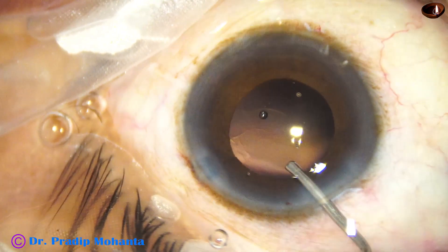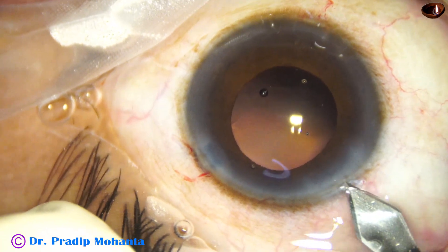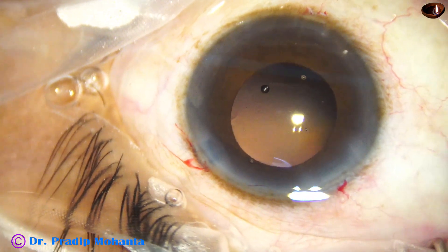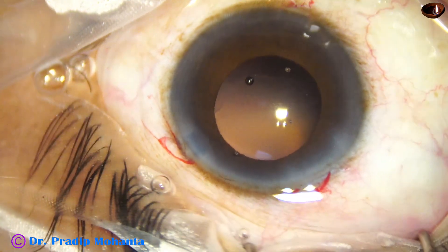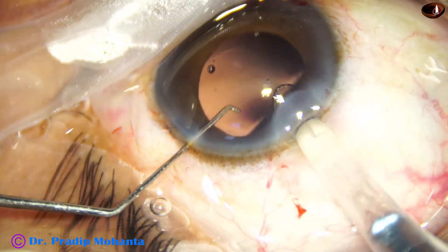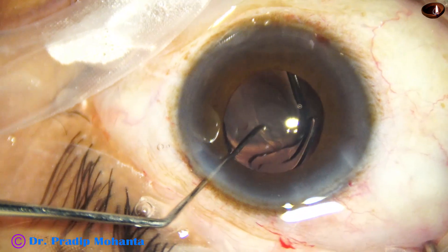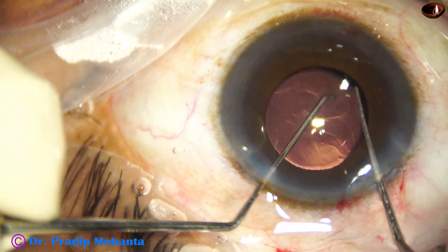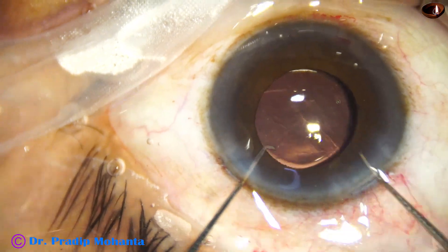Viscoelastic again — the pupil has come down to about 4.5 to 5 millimeters. And I am going to implant an intraocular lens. The main wound has been enlarged to about 3-point-something millimeters, and here goes the intraocular lens — this is a beautiful lens from Johnson and Johnson, Tecnis One. The lens goes in the capsular bag. I am checking whether the haptics are in the bag — yes, it is in the bag.